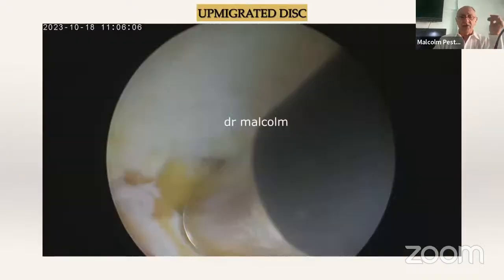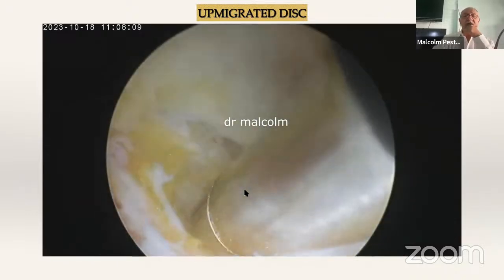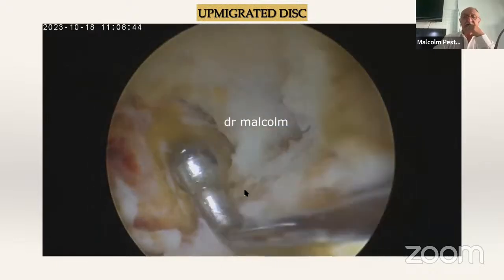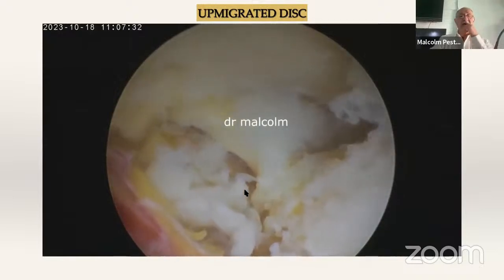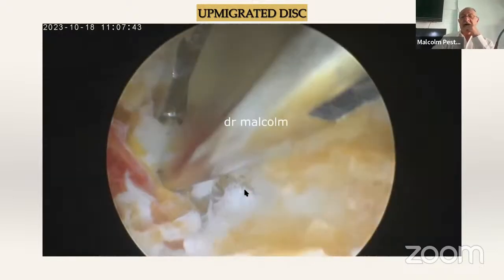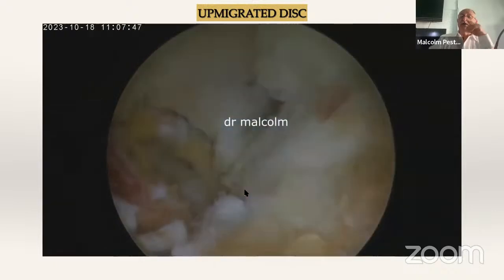Now, when you come to the lumbar spine, UBE gives you a great advantage. It gives you the ability to do what is called para-UBE. Para-UBE is much more comfortable than with a monoportal scope. You have a wider scope of manipulation over here. So I'm playing here, and you can see I've already done the SAP osteotomy. I've gone into the axilla from outside the spinal column after cutting the SAP. And here I'm removing an up-migrated fragment through the axilla.